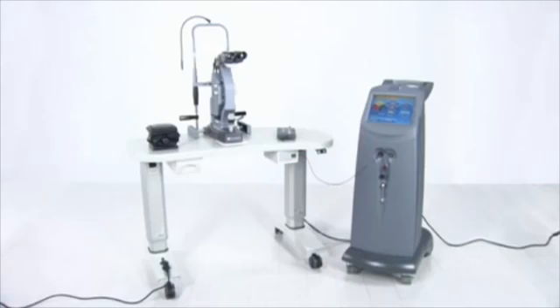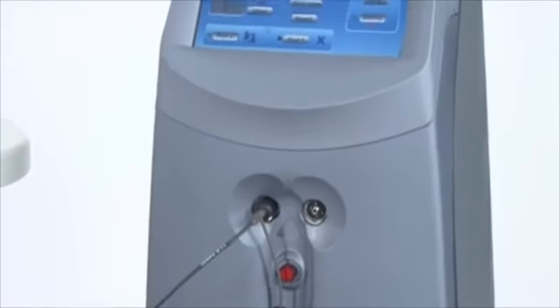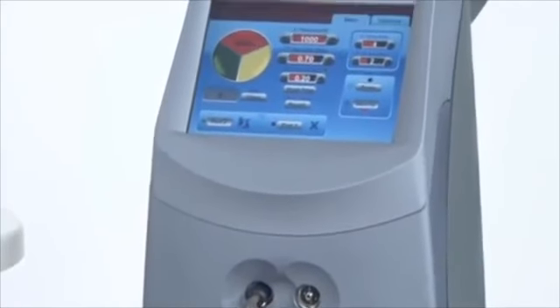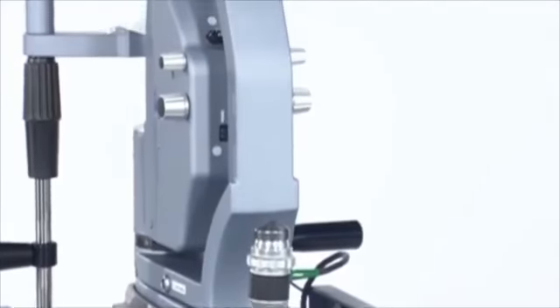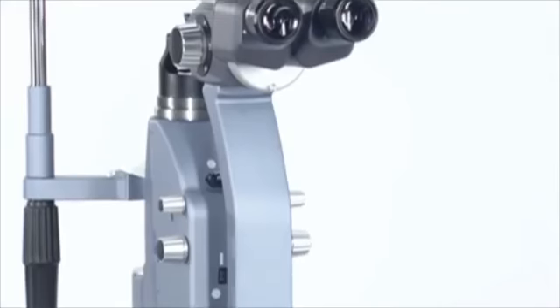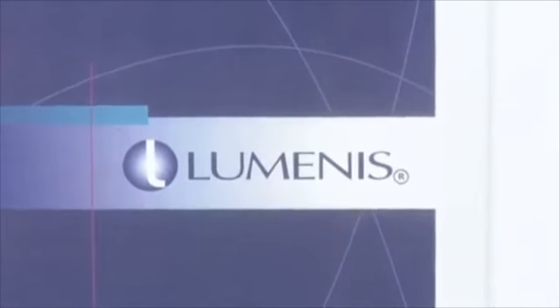Preventative maintenance, safety, power, and calibration checks should be performed annually by a Lumenis certified service engineer to ensure proper laser performance. All laser repairs should be performed by a Lumenis certified service engineer. For training and information, contact your local Lumenis service representative.